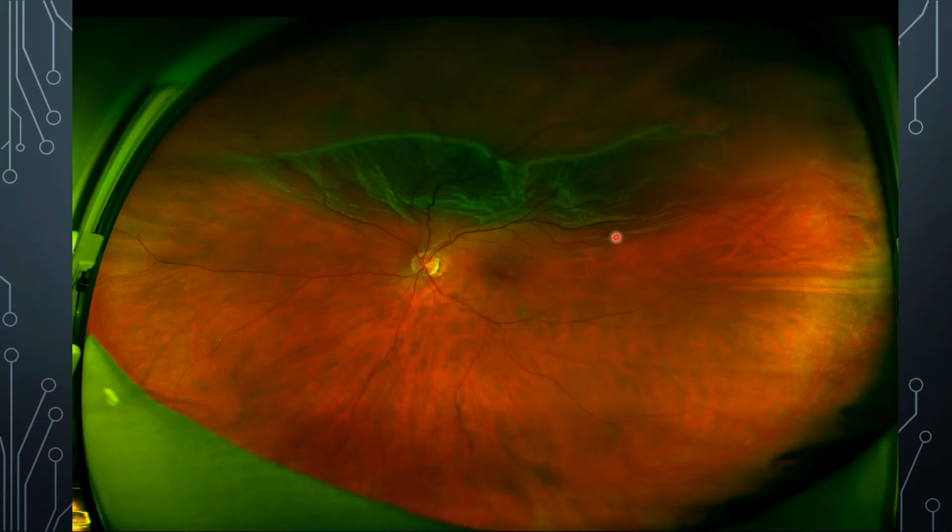This is an immediate referral to a retinal specialist to get this tacked back down, because once this fluid gets through the macula and the fovea and the retina detaches, the chance of regaining good vision is quite limited. So we're always looking to see, is the macula still on? And if it's still on, it's more of an emergency than if this has gone through that macular zone already. Still an emergent situation, but not as urgent as this case was.